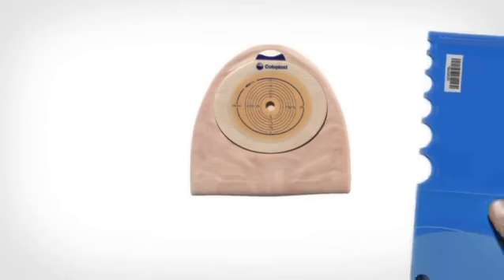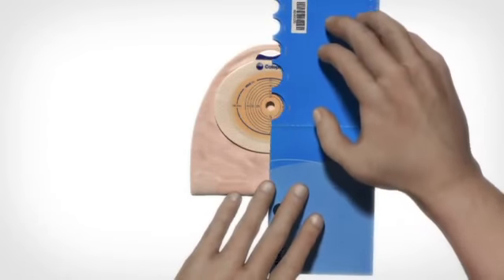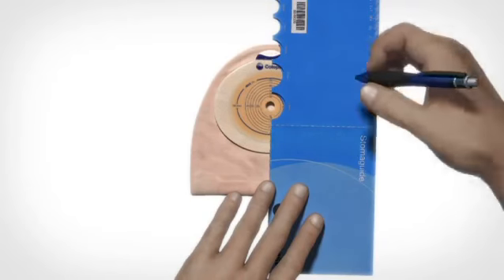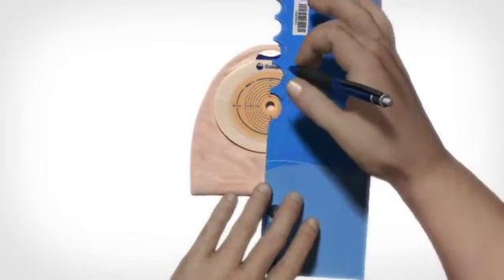Having measured the size of your stoma with the stoma guide, use the stoma guide to draw a cutting line matching these measurements on the back side of the adhesive.